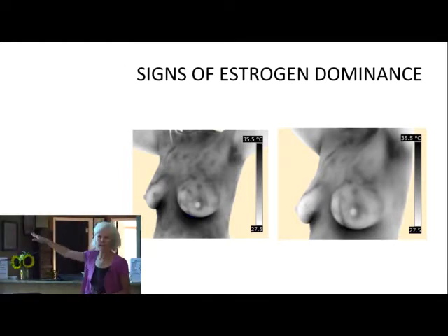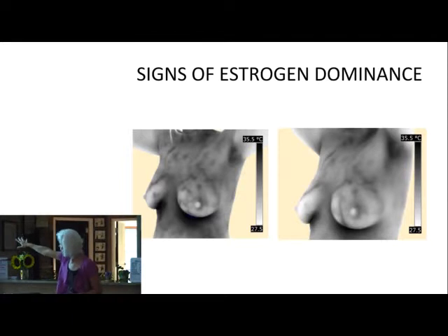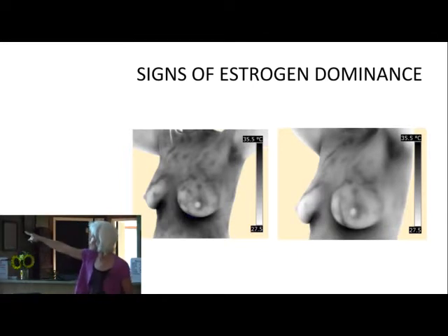And this is a perfect example, and that's why I put these images up. It's very clear that under stress, it looks like this. Calmer, beginning of the day, looks like this. Suppose you do this every day, you're stressed out. You're going to be like that continuously, and this estrogen dominance is going to be prevalent. It's a risk factor for breast health. It's going to lead to some breast issues.